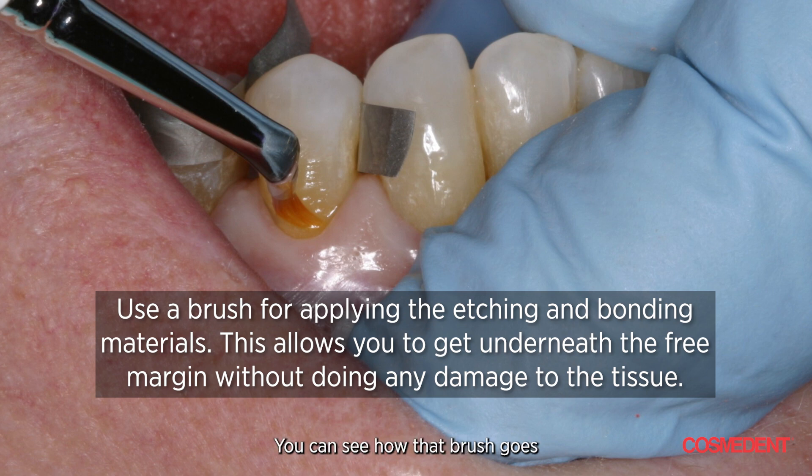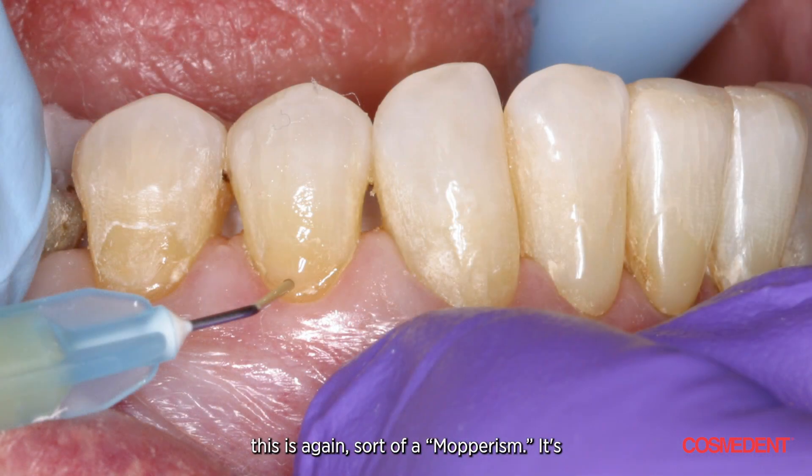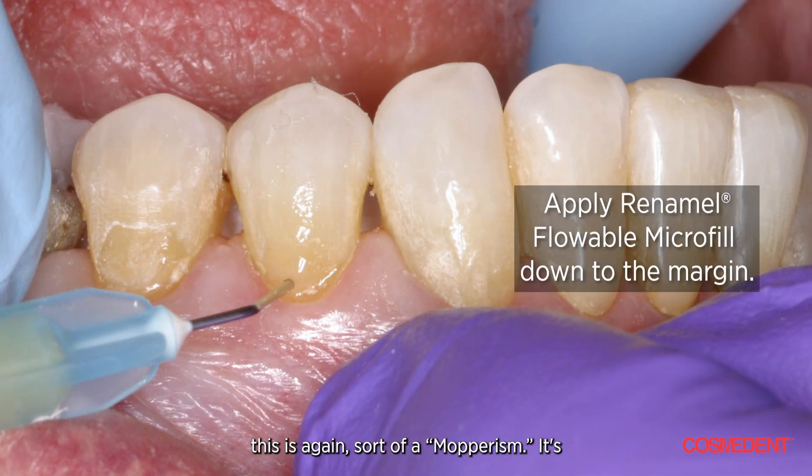I like the brush because you can tuck it underneath the free margin without doing any damage. You can see how that brush goes right underneath the free margin. We air thin it. Now, this is a key point — the most difficult part of doing a cervical restoration is blending it down to the cervical and having it stay on. So I thought, how can I make it easier? Let's try a flowable down there, because resin bonds to resin — it actually adheres to resin better than it adheres to tooth surface.